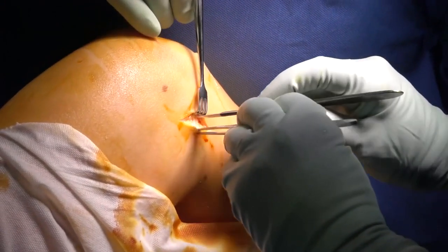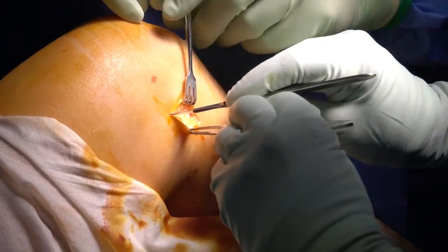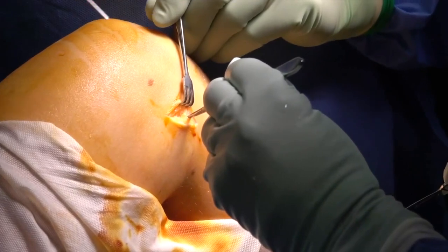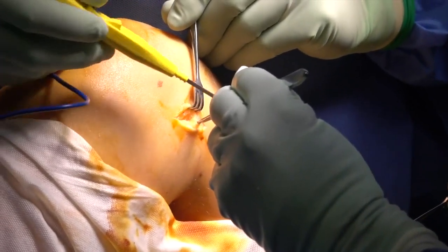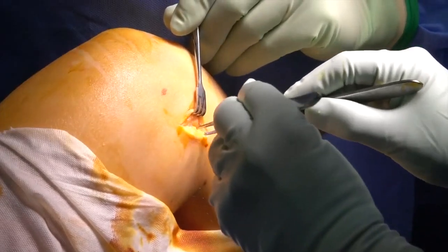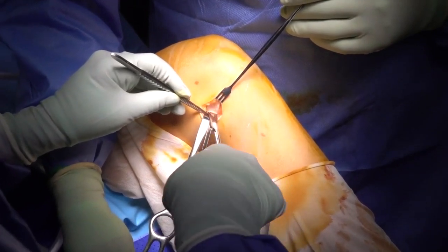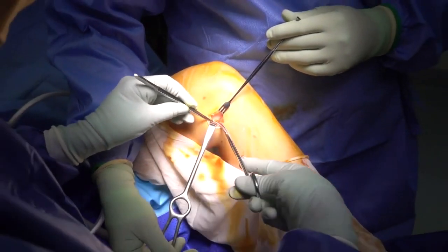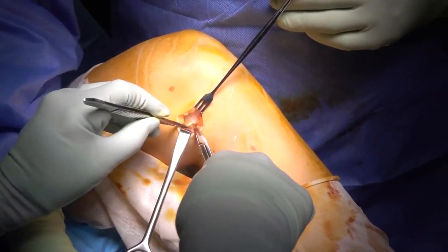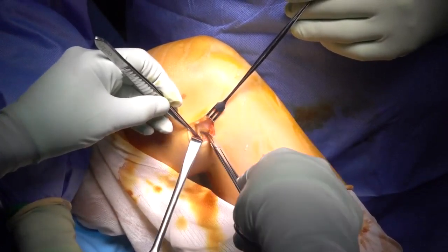Soft tissue dissection is then carried out down to the retinacular layer. The retinaculum is then opened to expose the joint capsule. Care should be taken to protect the branches of the saphenous nerve, which can often be seen crossing the surgical field.